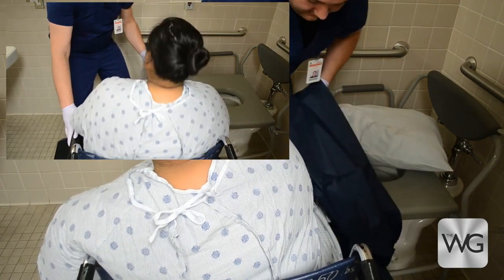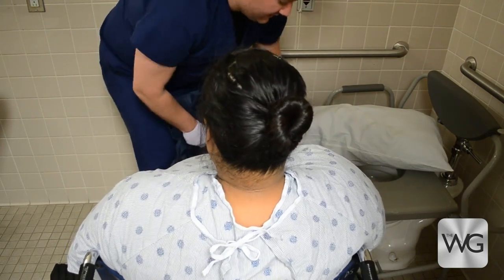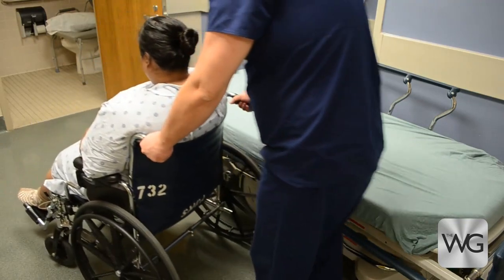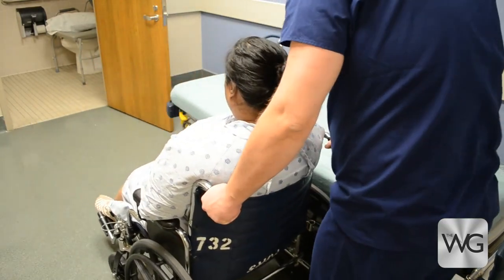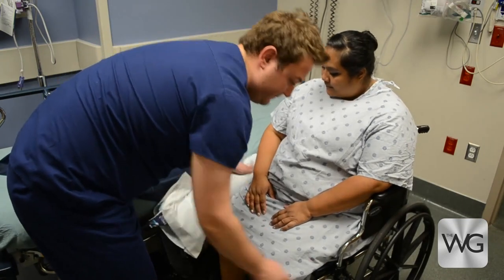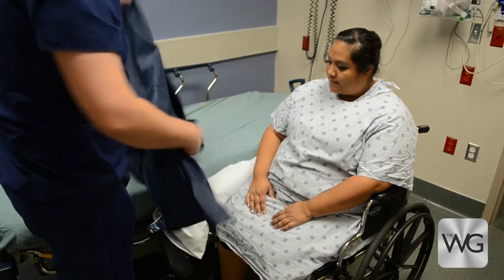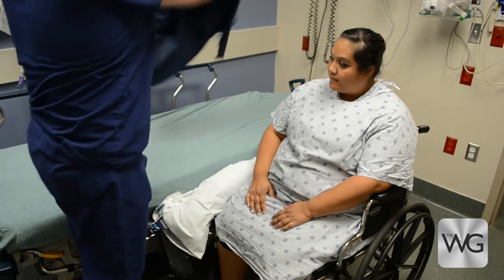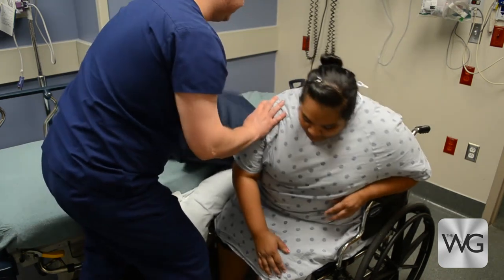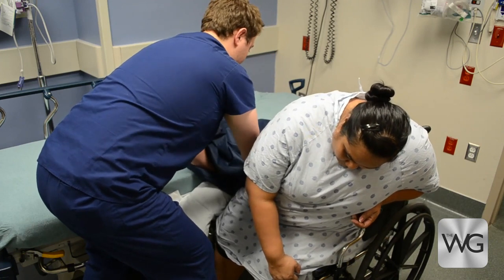If the patient is not able to stand or is not safe to stand, the patient should not be expected to stand. Using the wheelchair, the patient is safely returned to the bedside and the sit-to-sit transfer may be completed again. Just as before, a slide board, pillow, or bed linen may be needed to bridge the gap between surfaces. The patient is instructed to lean away from the direction of the turn. A single slide sheet is folded in half and tucked under the patient's buttocks and thigh.